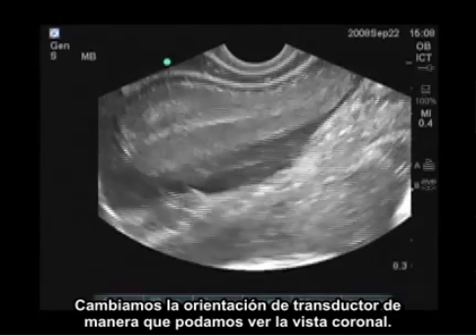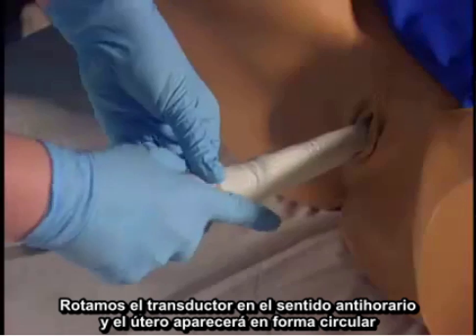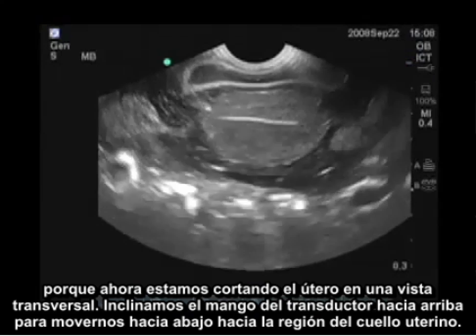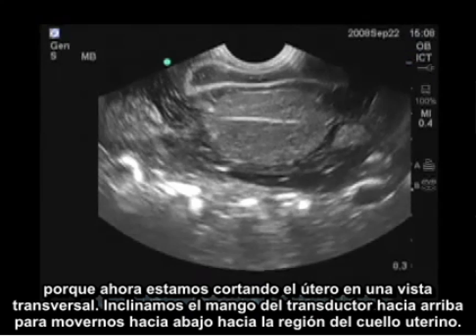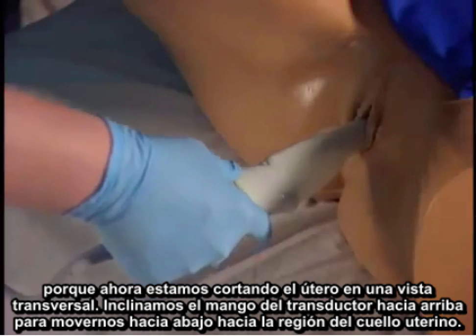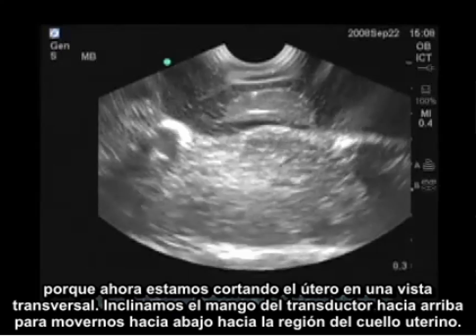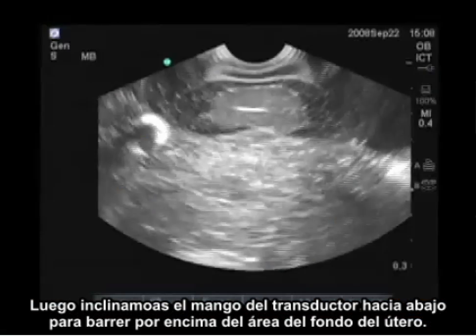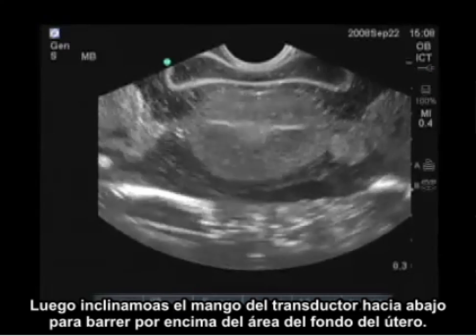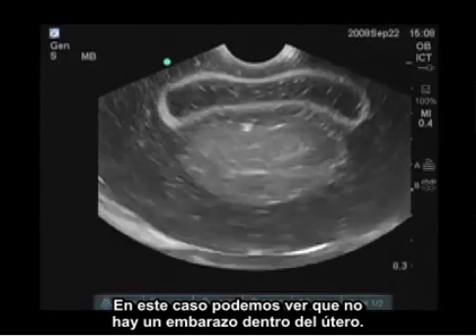Now I'm going to change the orientation of the transducer to a coronal view by turning the transducer counterclockwise. The uterus will appear circular because we're cutting a cross-sectional view of it. I tilt the handle up to move inferiorly into the region of the cervix, then bring the handle down to scan superiorly into the area of the fundus. In this case, I can see there's no pregnancy inside the uterus itself.